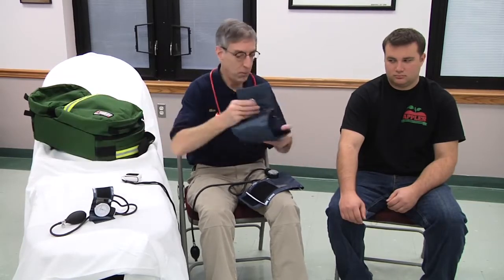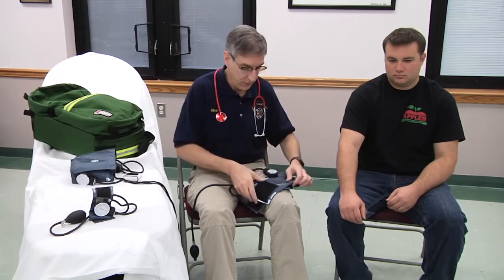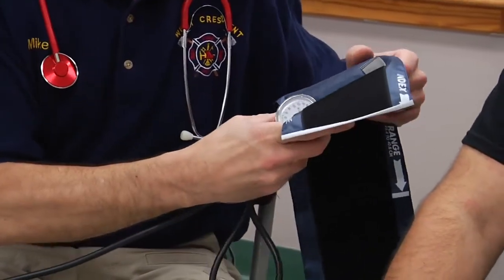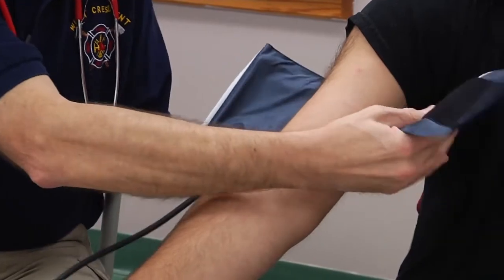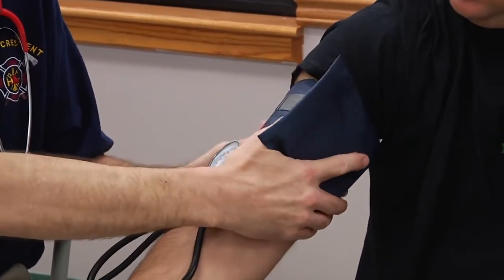If I was to choose a large adult cuff, it would probably be too big for this patient. If you use a cuff that's too large, you're going to get blood pressures that are falsely low. If you use a cuff that's too small, you'll get blood pressures that are falsely high. So this normal adult-sized cuff is probably the appropriate size for this patient. I'm going to wrap the cuff around the patient's arm — now I have the appropriate sized cuff to use.